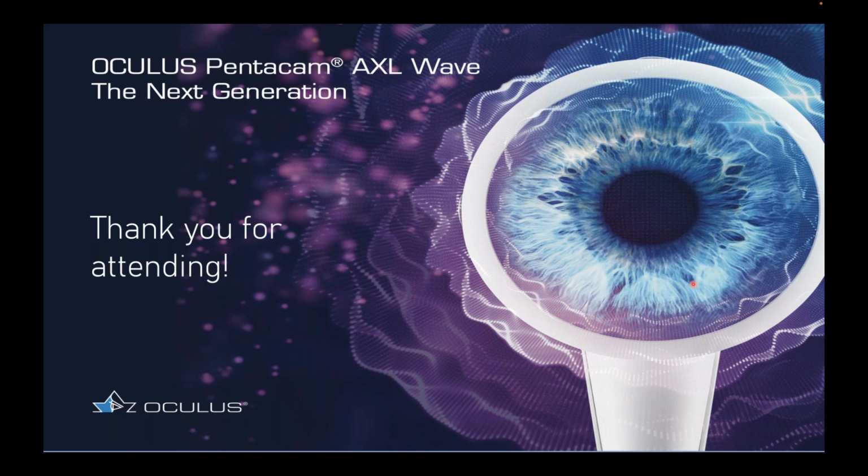And when the cones are not centered, which they often aren't, those patients, while they may see well, have a lot of glare and halos. And over the years, decades ago, I would try to refit them with bigger lenses, and it would never work. And recently, now having the Pentacam data, I've actually redesigned large freeform lenses, and I've been astonished at how well they do work. Have you done similar things with corneal GPs?